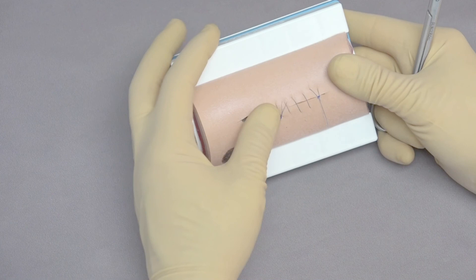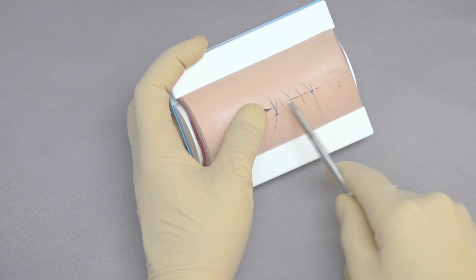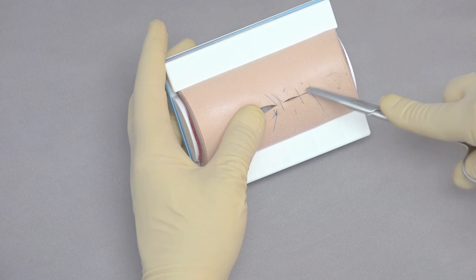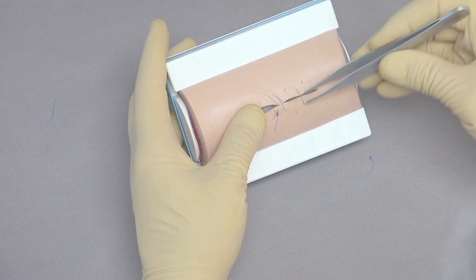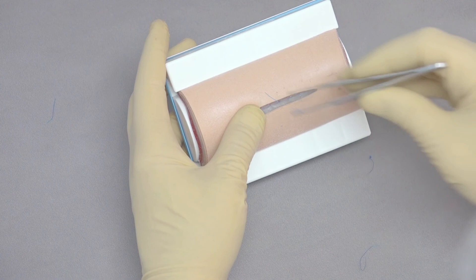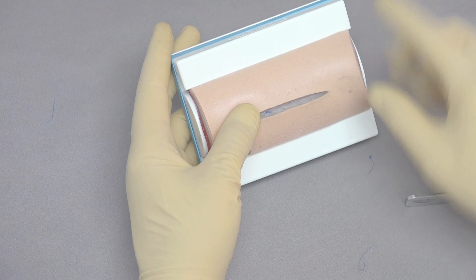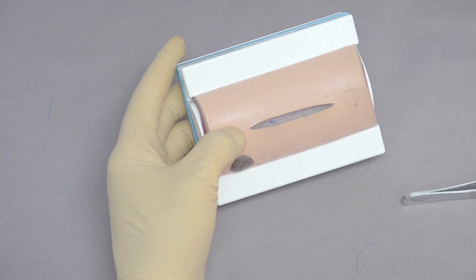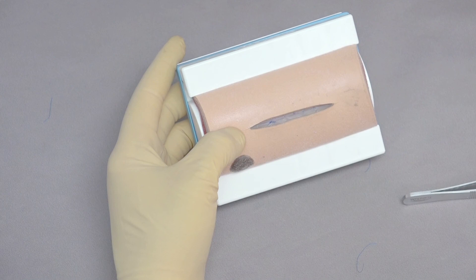What's great about this is you can critique your work — you can see this one was placed a little further away, the spacing is pretty good and even, though maybe two are a little further apart. You can look at it and decide to practice again. Just cut the sutures out, remove them, and start again. You can see small holes where the suture line was, but that's it. You can do this over and over, 10 to 15 times, to master closing the skin, subcutaneous tissue, and fascial layers.